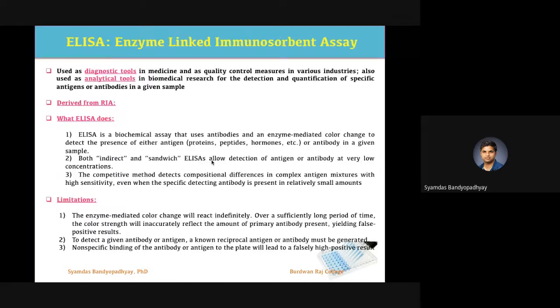Right? So if you have any questions, you can always ask me. And next, these are all about RIA, radioimmunoassay. Now we'll move to ELISA, which is enzyme linked immunosorbent assay.